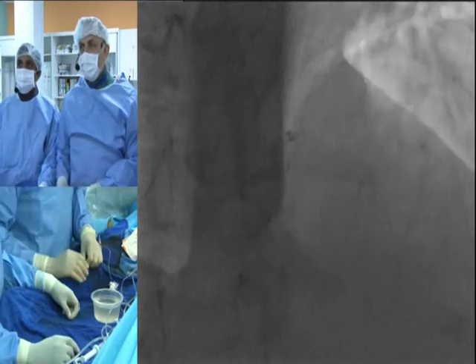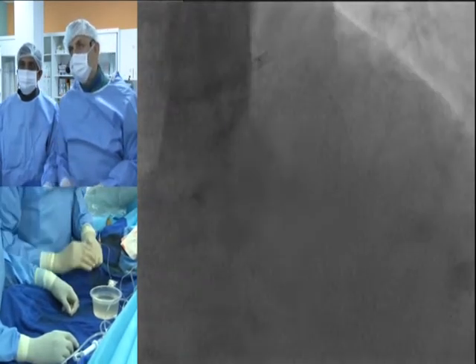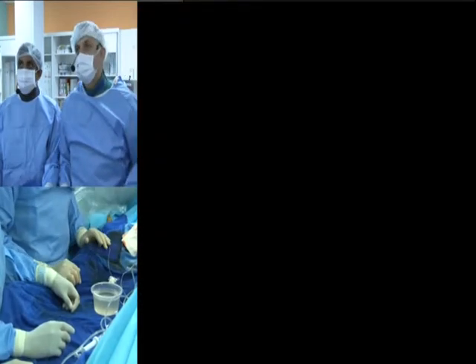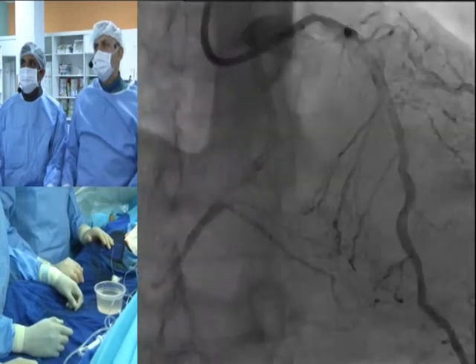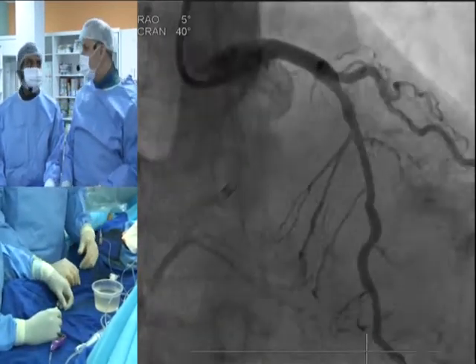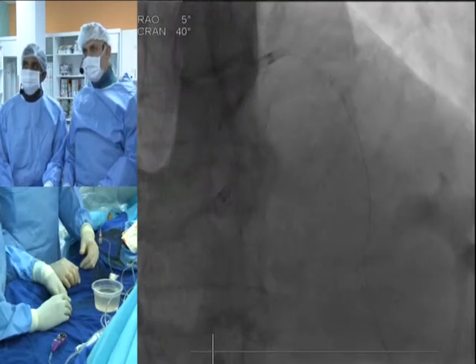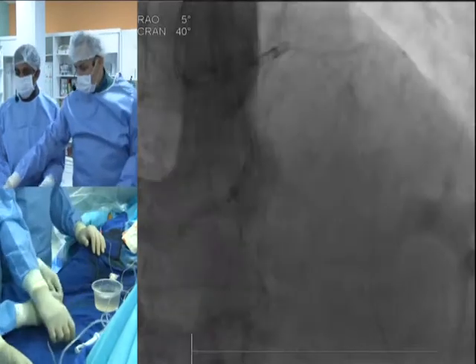Okay. Then we have stenosis in this patient. It's moderate stenosis in the LAD. We would like to see that, and we would like to treat if necessary. Yes, please. Okay, I don't think it's a severe one. It's less than 50%. What do you think? I think it's about 40, so I think we don't have to treat this actually. And if you go to left, please, we will do a bilateral injection now.